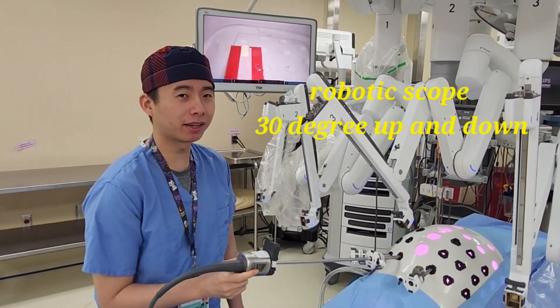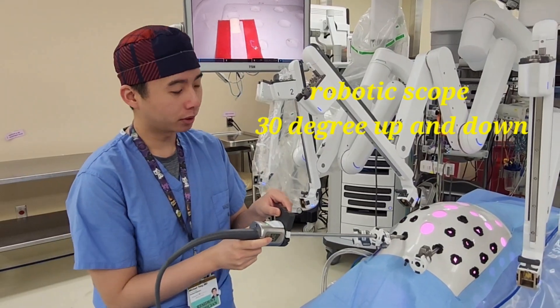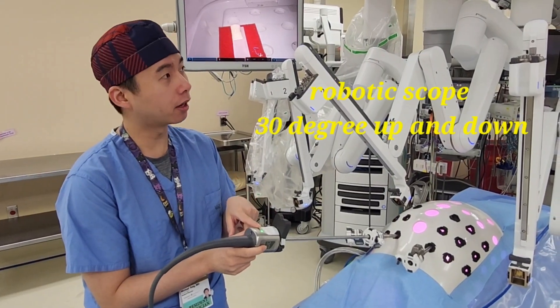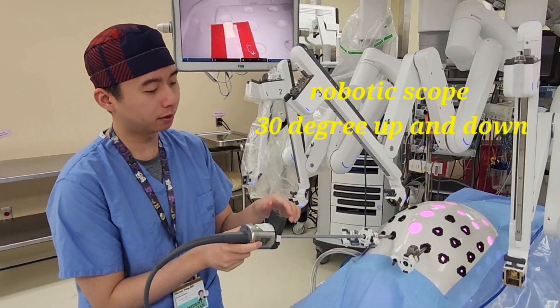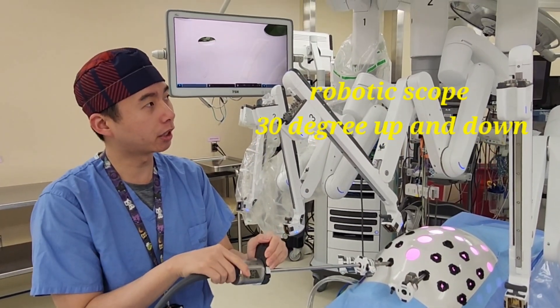If you want to use the robot camera as a laparoscope, make sure to have the gray buttons facing up at all times. When the buttons are facing up, you can use the camera to point 30 degrees down, and when you move the camera so the buttons are on the bottom, you'll be looking 30 degrees up.